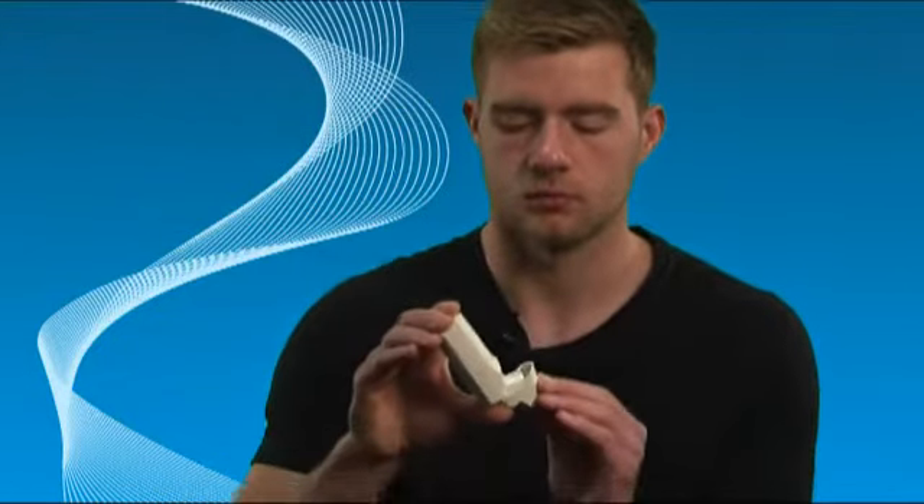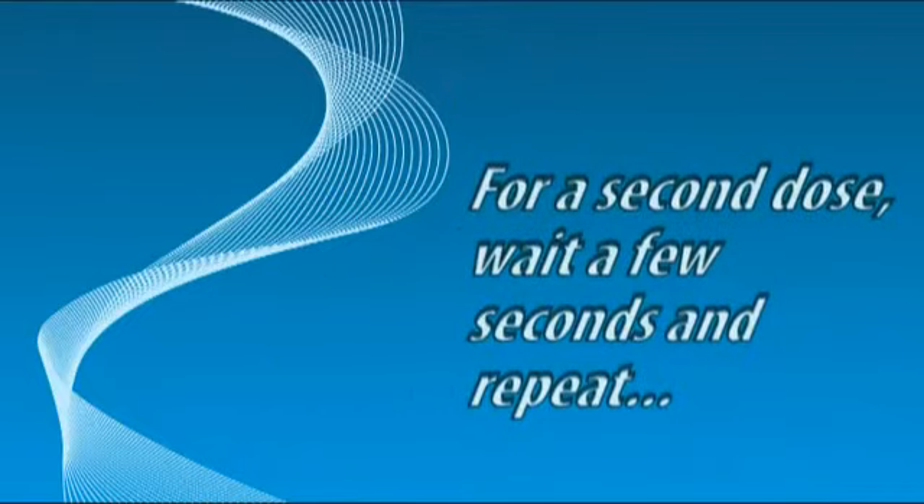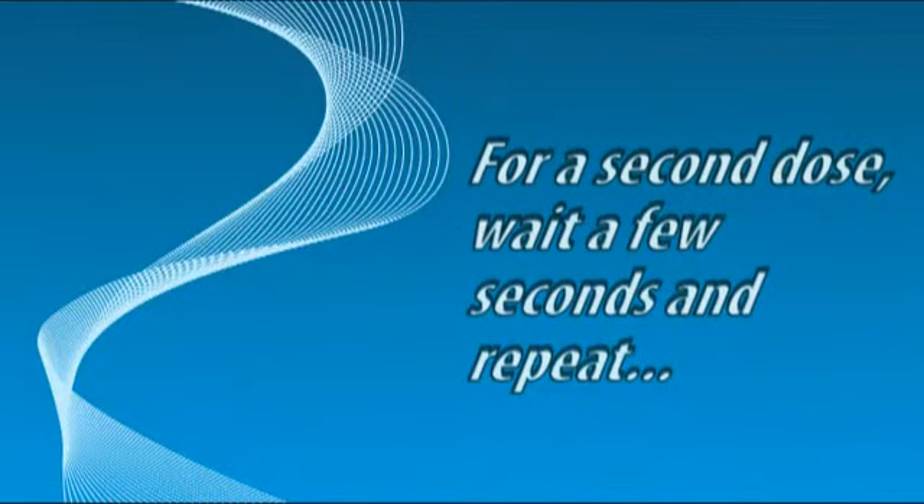After use, hold the inhaler upright and immediately close the cap. For a second dose, wait a few seconds and repeat.